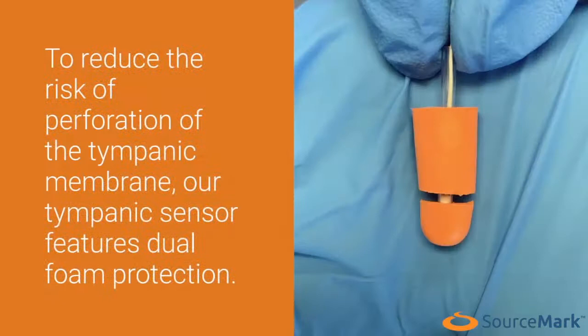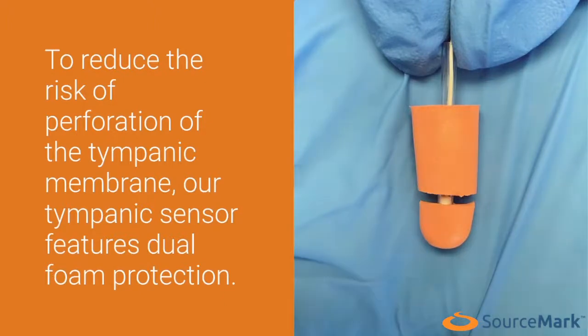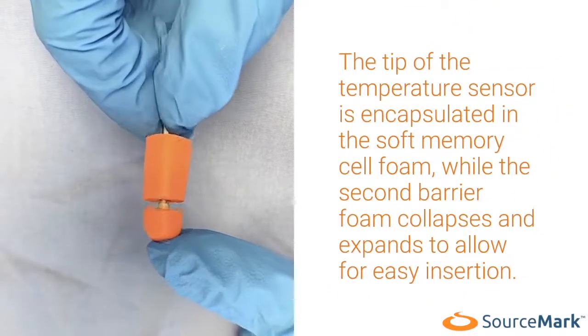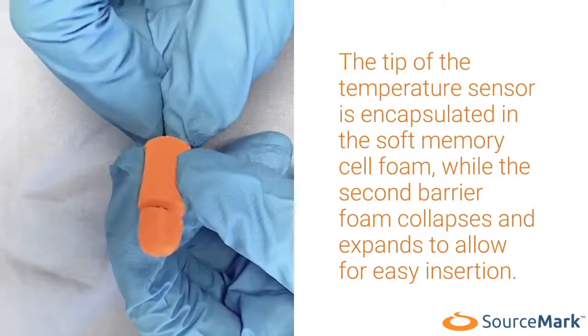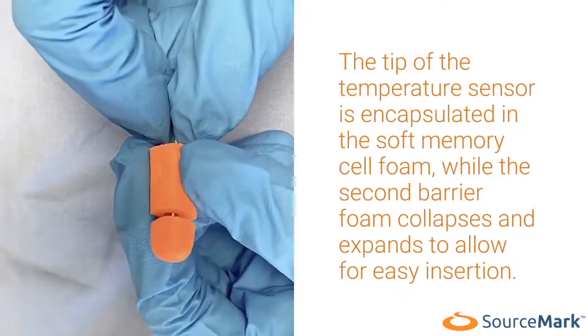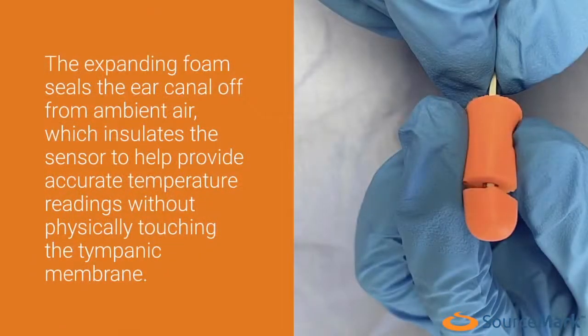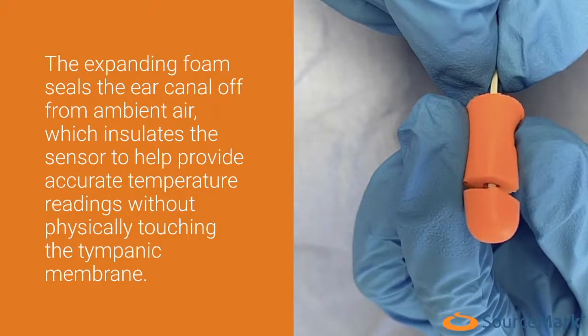To reduce the risk of perforation of the tympanic membrane, our tympanic sensor features dual foam protection. The tip of the temperature sensor is encapsulated in soft memory cell foam, while the second barrier foam collapses and expands to allow for easy insertion. The expanding foam seals the ear canal off from ambient air, which insulates the sensor to help provide accurate temperature readings without physically touching the tympanic membrane.